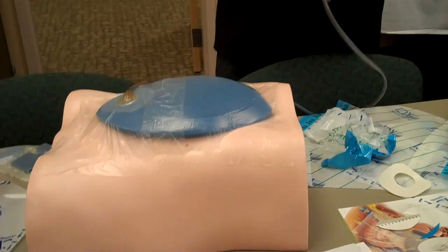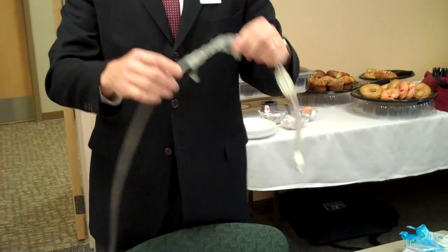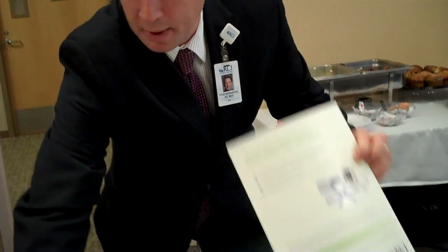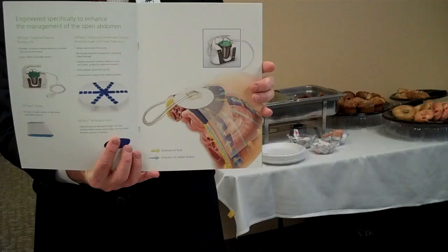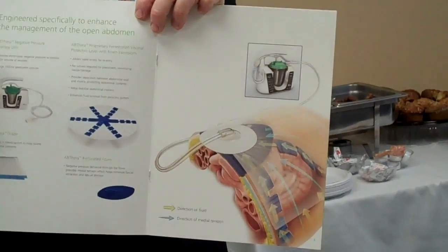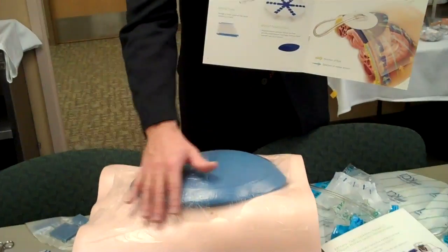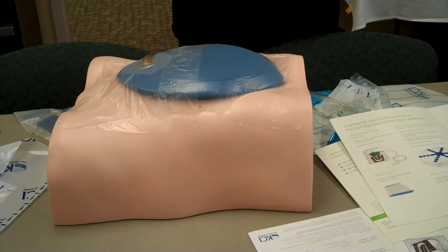This is the end that goes into the pump, and the canister itself sits right on top. The 1,000 cc canister goes into the pump. The pump has a two-hour battery. You initiate the power of the pump with the power button. Once you start the power on the pump itself, it starts the negative pressure immediately — there's no other on or off button. Once you get the negative pressure on, you should see the granule foam shrink down as well as re-approximate those fascial edges.